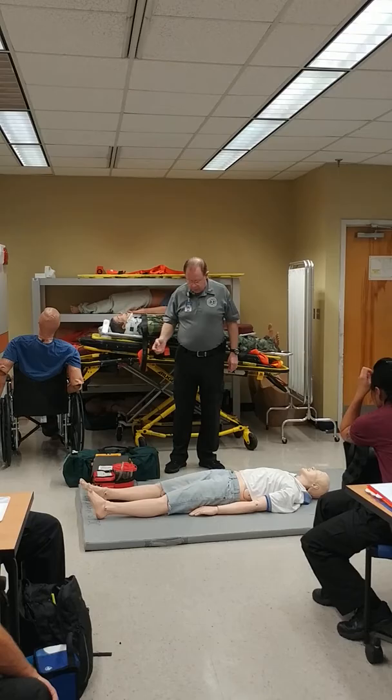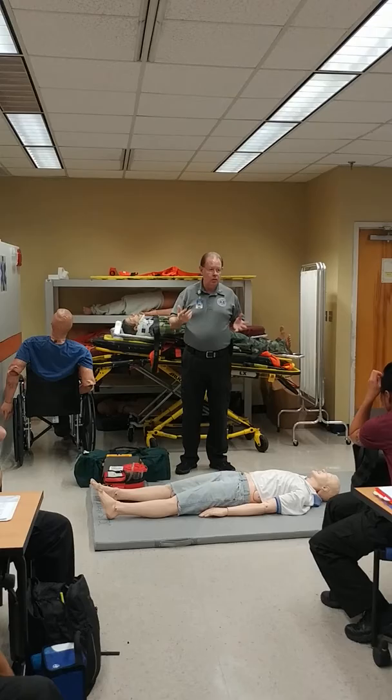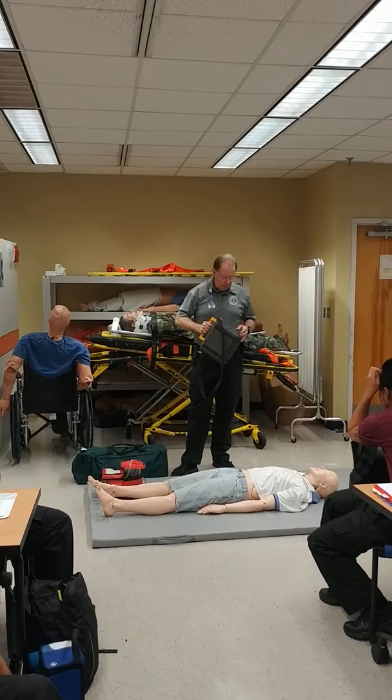Once I set the AED up, it's designed so I don't have to interrupt compressions to do it, because where the pad is going to go won't block doing compressions.